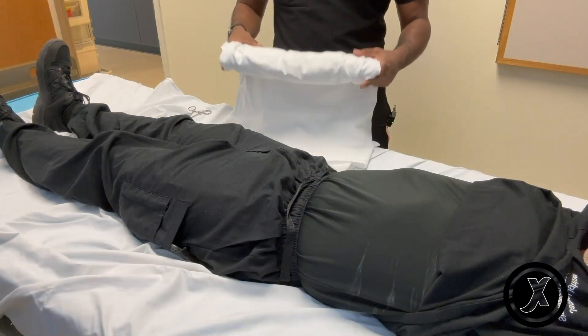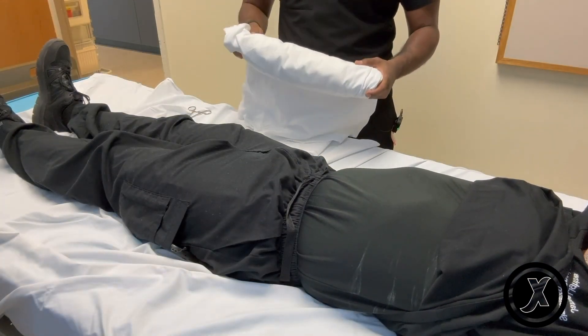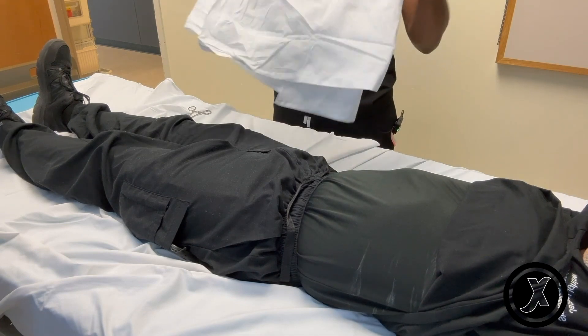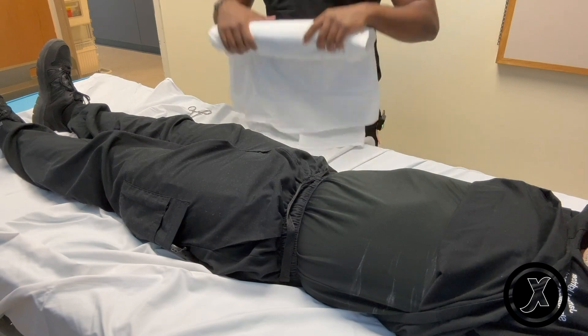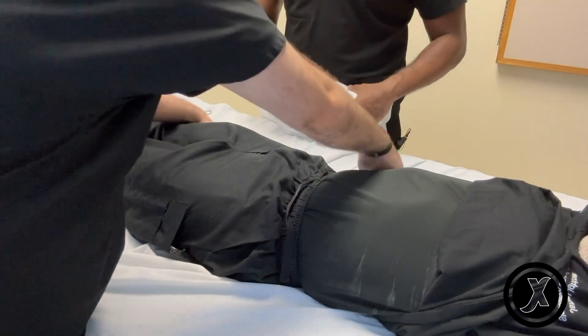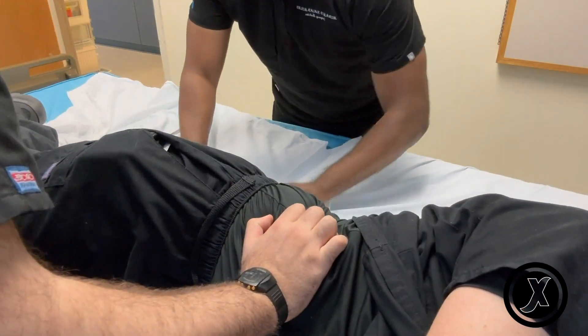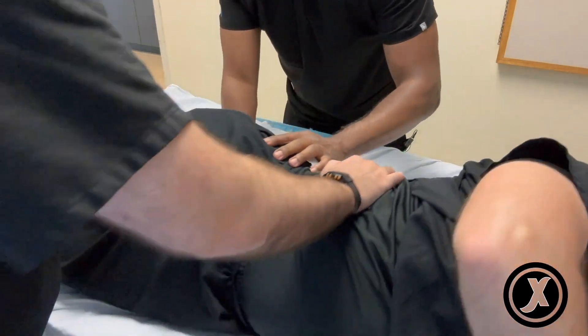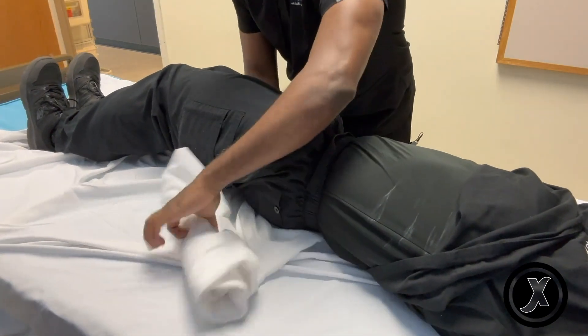Now I'm going to show you how to improvise by using a bed sheet as a pelvic binder. We have this pelvic sheet here, and I've already rolled it. Someone is holding C-spine for the patient and someone is doing the log rolling. Then roll the patient to their right side — and roll them back.